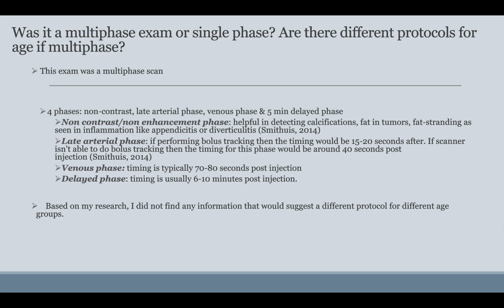And based on my research, I did not find any information that would suggest a different protocol for different age groups. The only thing that I did come across was a different dose of contrast to be given depending on how much the patient weighs.